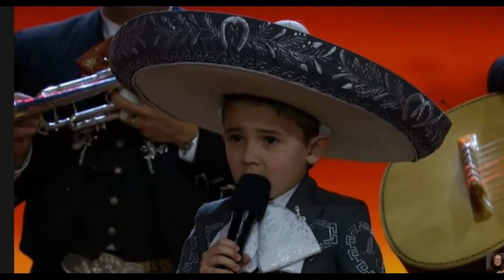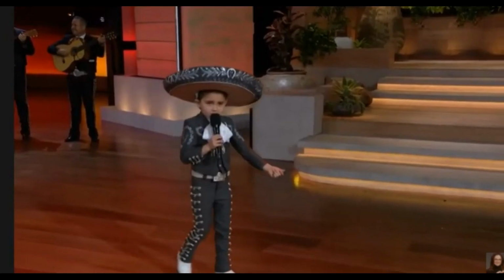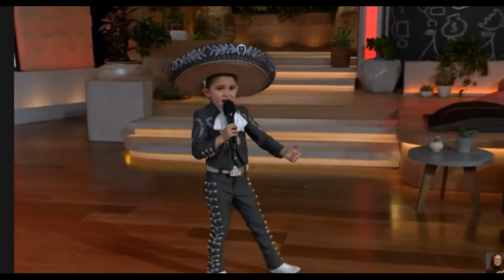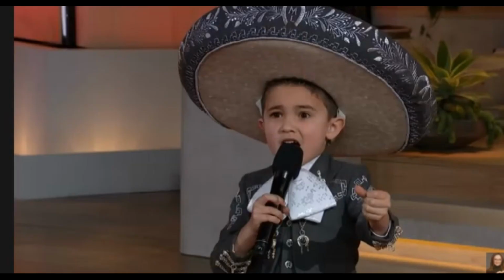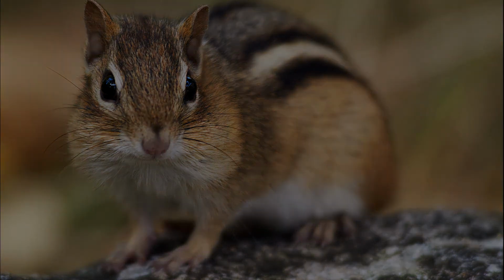Hello everyone, I'm the little boy singing voice. I hope you think my voice is pretty. Hey, how about me? I'm not just anyone, I'm the chipmunk voice.